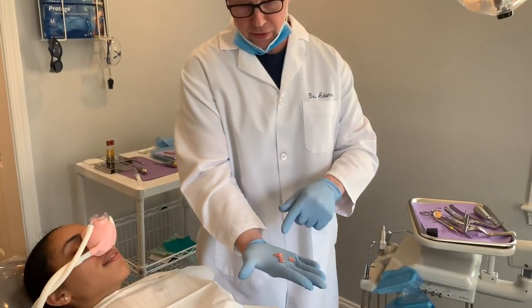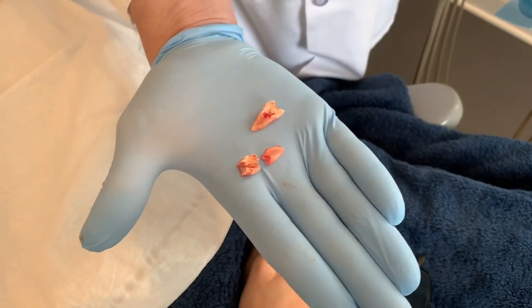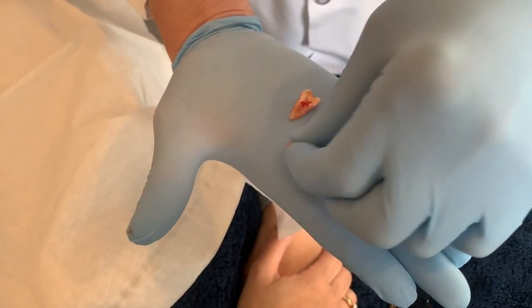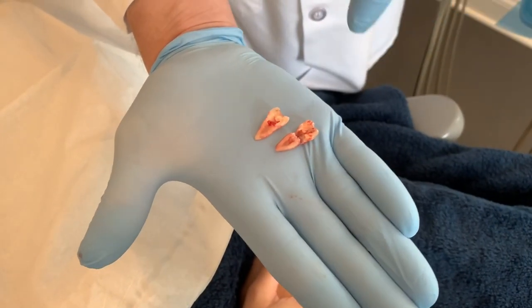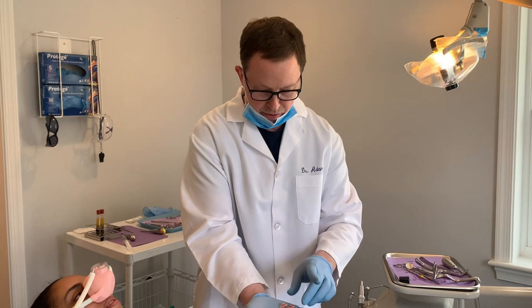At this point, we've actually gotten the tooth out. As you can see, this root came out very cleanly in one piece. We did a really good job of just separating it right down the middle. This is the actual other root. And then in the process of extraction, the crown separated from the root. But I think, needless to say, it was pretty smooth. I think it took us maybe 3 or 4 minutes to get this tooth out.